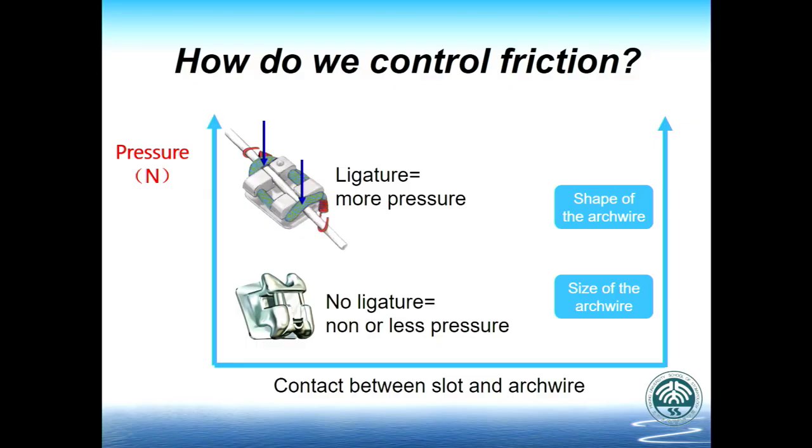So we can think about in which situation we have no ligature or we don't need ligature. Just like this, self-ligating brackets. I know from this morning you use the Damon brackets here also, right? So this is the Damon MX, and now we have Damon Q.